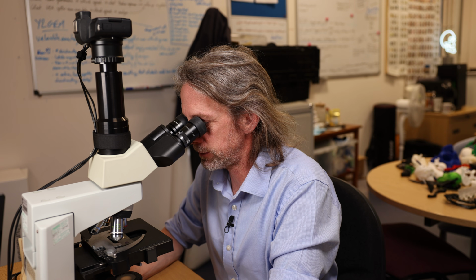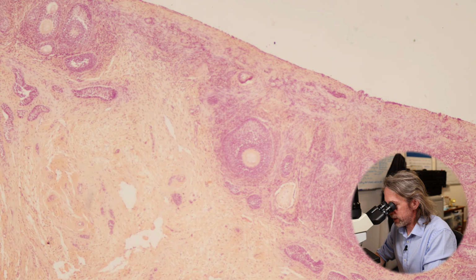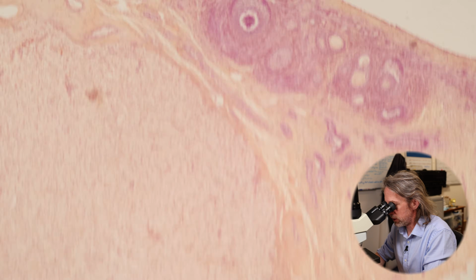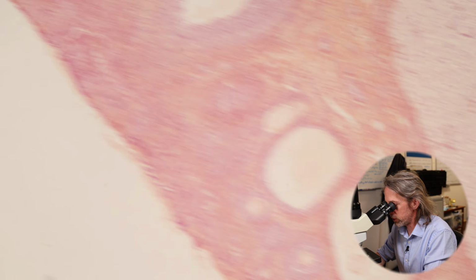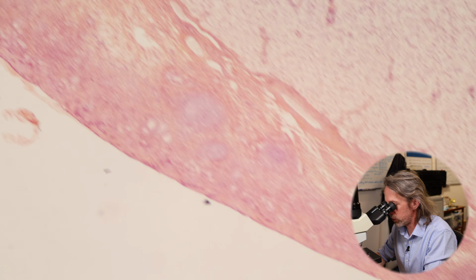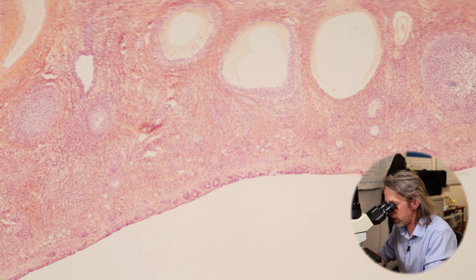All right, so that is the histology of the ovary. Again, I think it's quite different to all the other tissues. It looks quite weird, but if you start at the outside and you start seeing all those circles, you recognize all those primordial follicles that kind of sat there waiting for their chance.